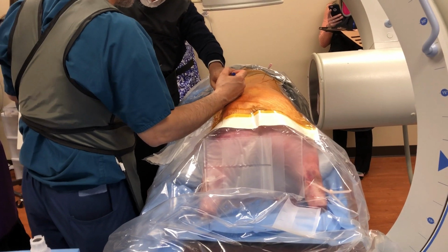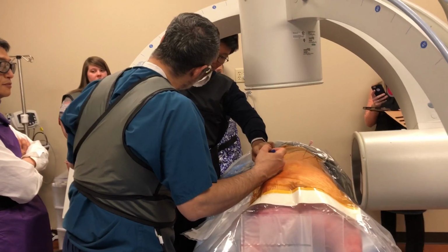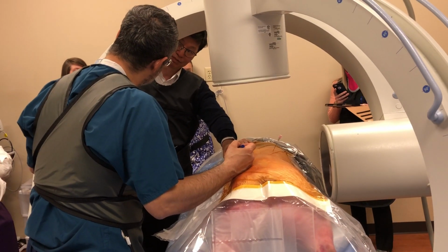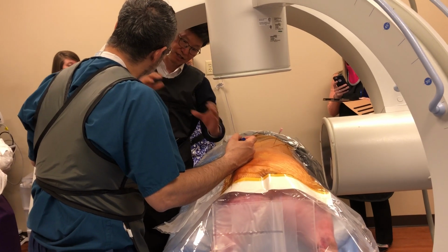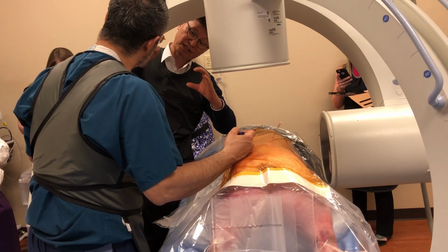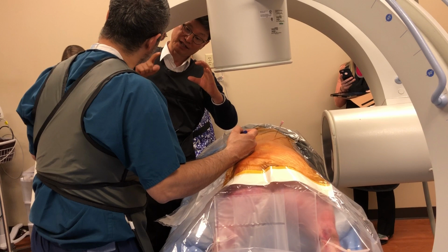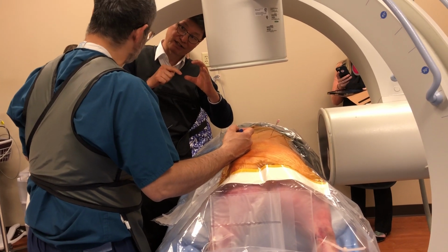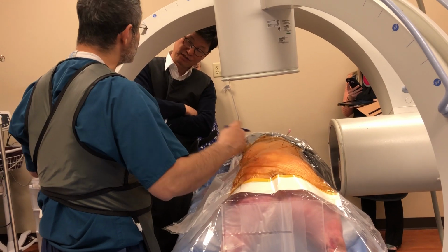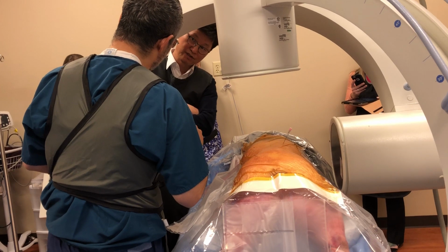One question. Your theory is okay when there is no obstacle in between. I mean this disc space, this is the entry point. If there is no obstacle here, then you are right. But if there is a big facet like this, big osteophyte, you cannot enter. No, this bypasses all of them. With this approach, that's oblique, that's not the far lateral. You're absolutely right about that.